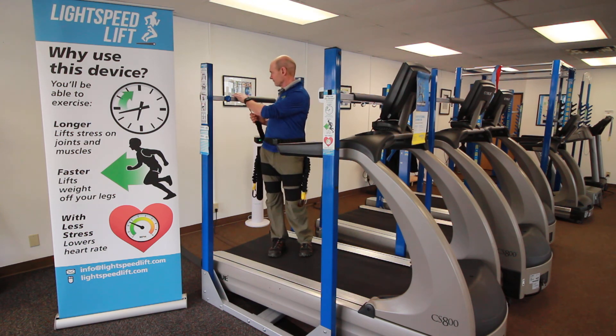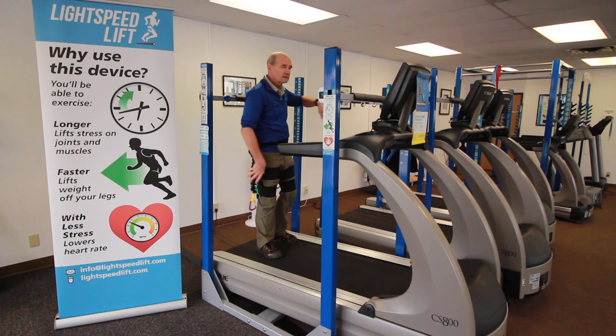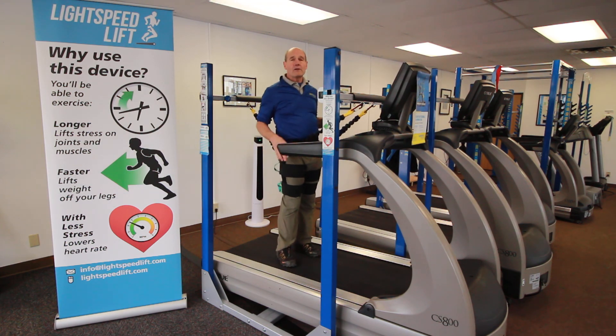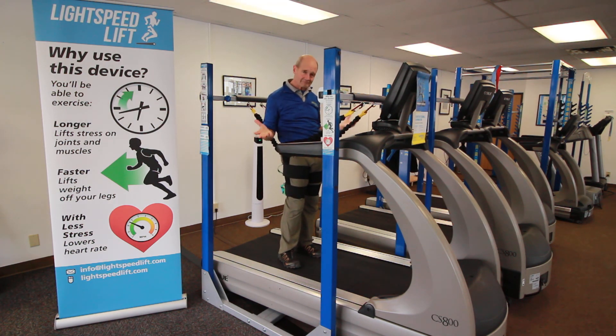Clip the back. Grab a hold. Clip the front. And now I'm lifting up by another seven pounds — which might not seem like a lot. But clinically, having worked with hundreds if not thousands of patients over the years, I found this to be a tremendous change. Just that seven pounds. If more is needed, there are ways of getting even a little bit more.